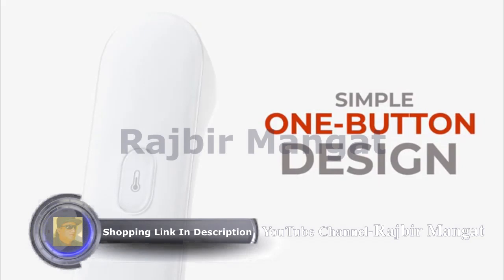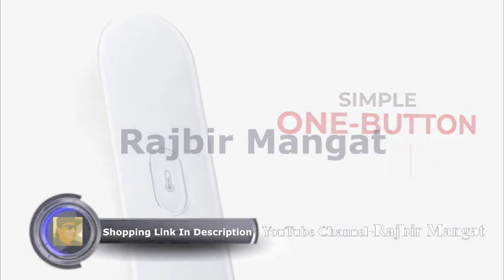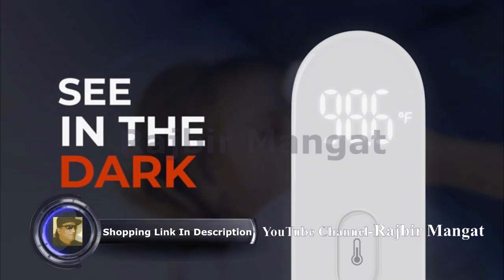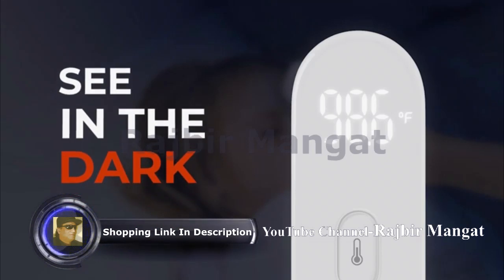A sleek, one-button design makes taking a temperature simple. Just hold the button until you feel a gentle vibration. The LED screen displays the reading in bright white light, so you can clearly see it even in total darkness.